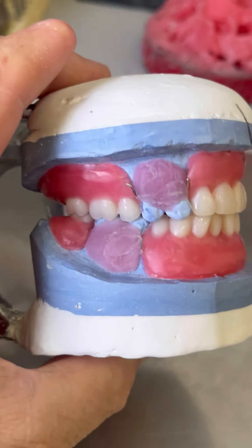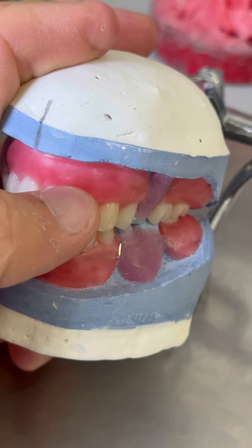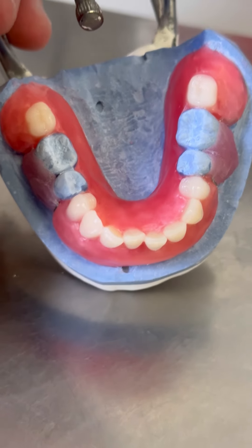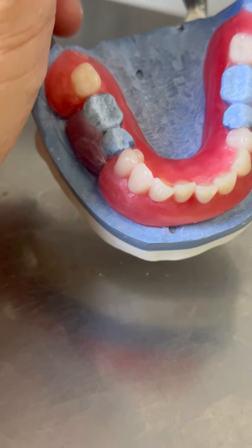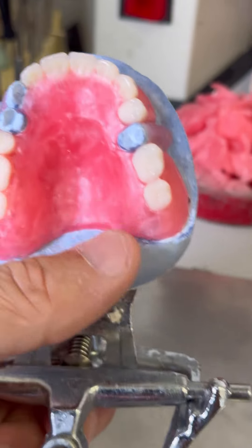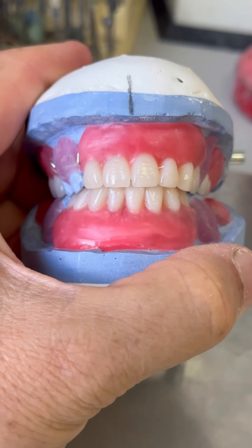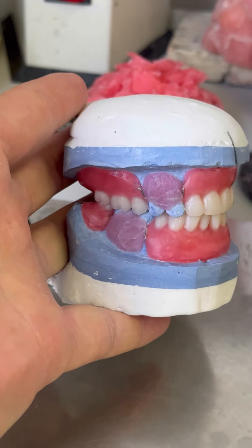Поставили зубки вместо тех зубов, на которых был поставлен крест. Вот так теперь он выглядит. Обращаем внимание на нижние зубки: у него на самом деле такие зубы, что в дуге не хватало места и они были искривлённые. Поэтому места так же мне не хватало, и я взял их, поставил так же — ну, это допускается. Центр верхних зубов я выдержал, поставил.